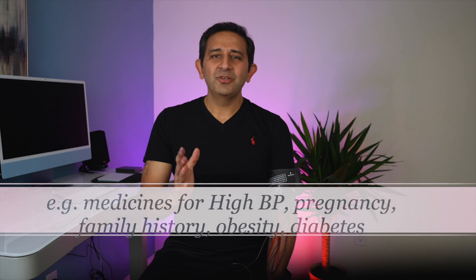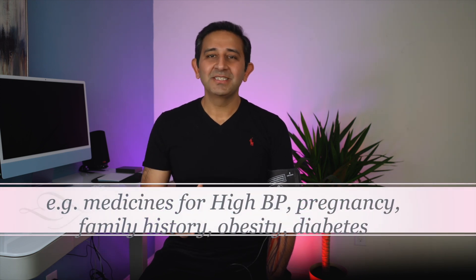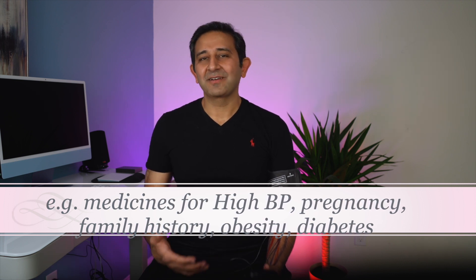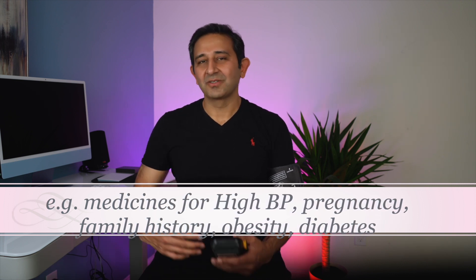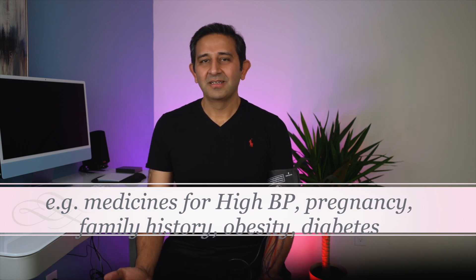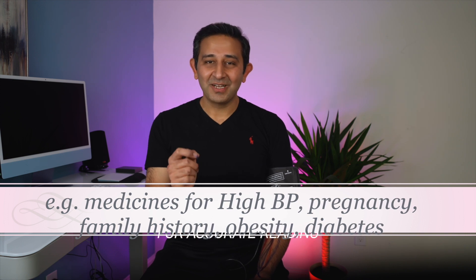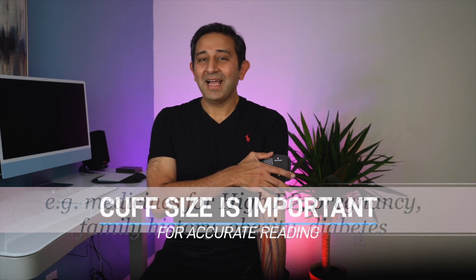Situations where you want to measure three times include if you take medicines for high blood pressure, if you're pregnant or have risk factors like a family history of high blood pressure, diabetes, or obesity. One important tip is to use a cuff that is the correct size. The one shown here is for adults, but for someone who is obese or has big arms, you need a bigger cuff, and for children you need a smaller one. If the cuff size is wrong, the blood pressure readings can be wrong.